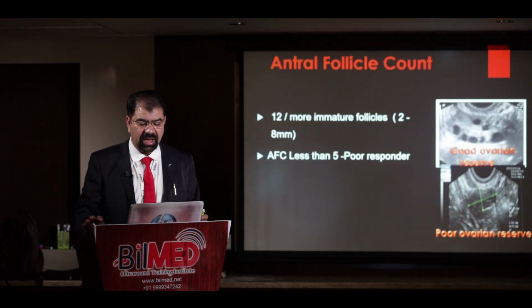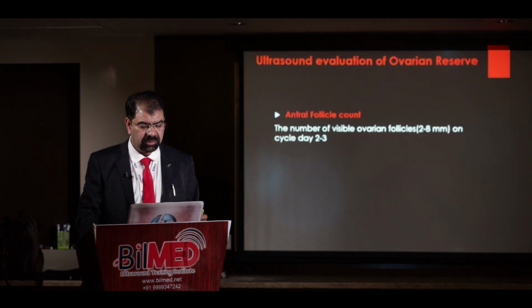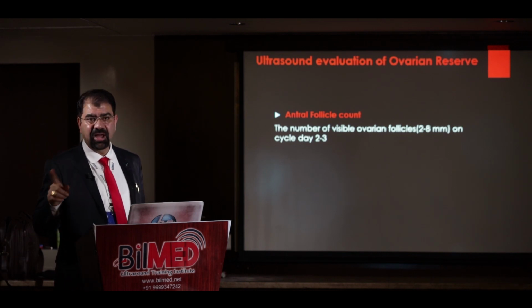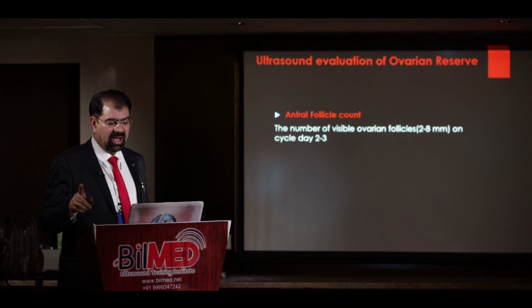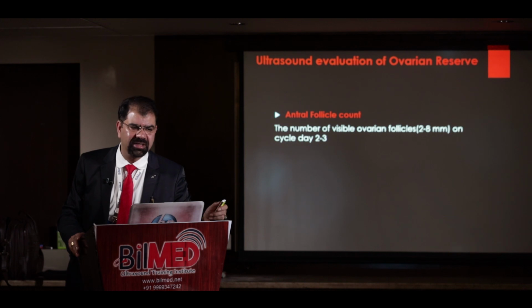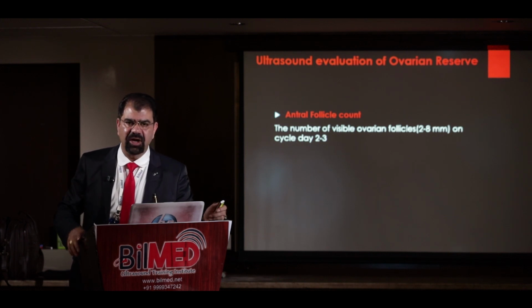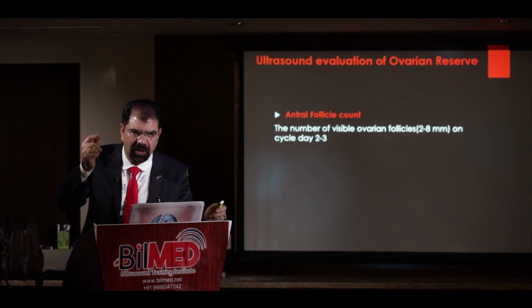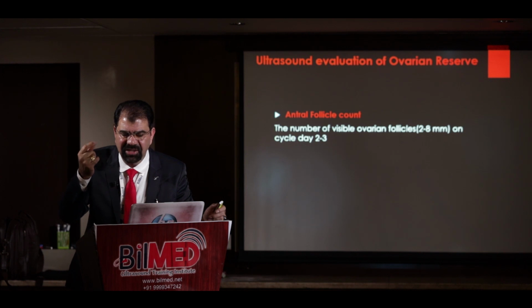One more thing, the antral follicular count. I have to take a baseline scan at about day two to three, and I have to see the antral follicular count. What does this antral follicular count mean? AFC, antral follicular count, means how many follicles I am seeing, count wise.